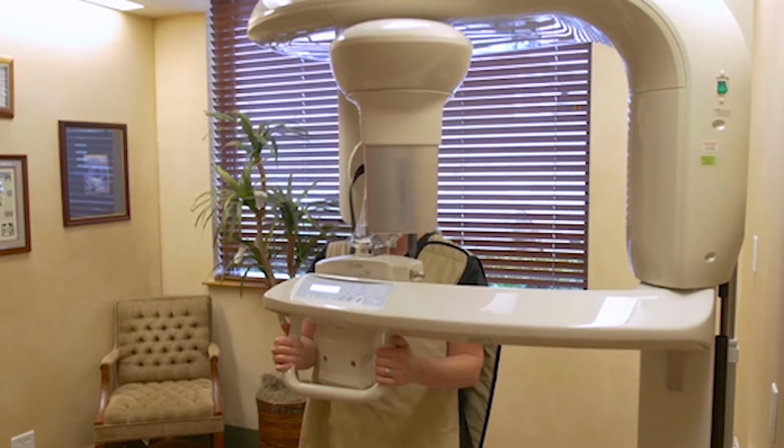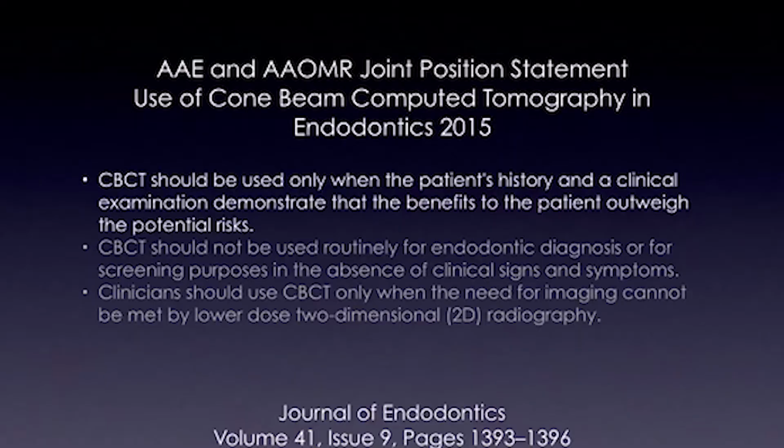Regarding the importance of this technology, the American Association of Endodontics and the American Academy of Oral and Maxillofacial Radiology issued a joint position statement on when CBCT should be employed. This paper starts out by telling us when CBCT should not be used. It said CBCT should only be used if the patient's history and clinical examination demonstrate that the benefit to the patient outweighs the potential risks.